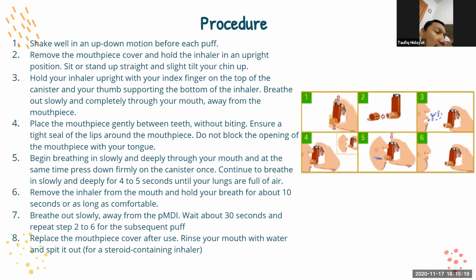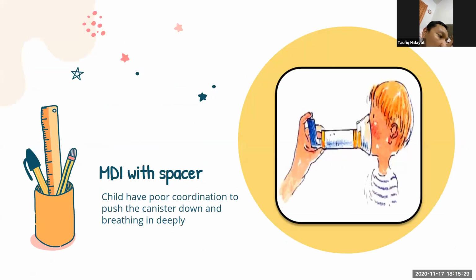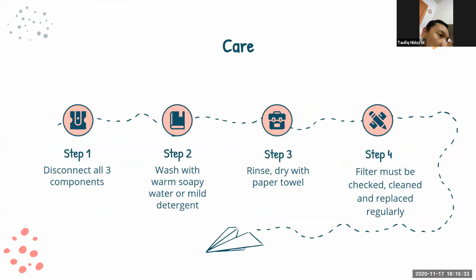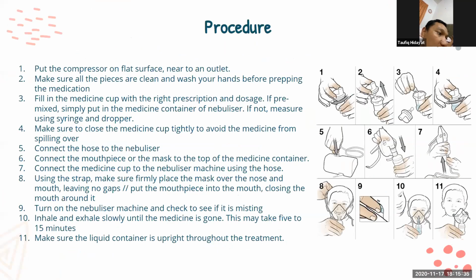Okay, and then another one is of course nebulization. Nebulization is a known procedure in the ward, before the COVID era. In our protocol, every child with bronchospasm or bronchoconstriction got bronchodilator nebulization. If no spasm, maybe nebulize with saline.